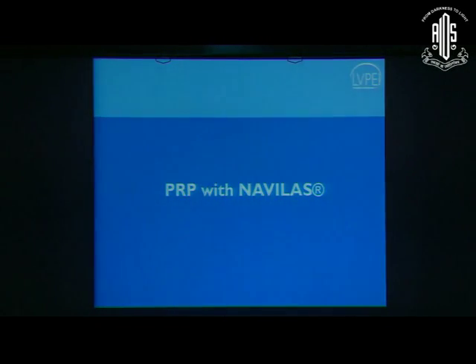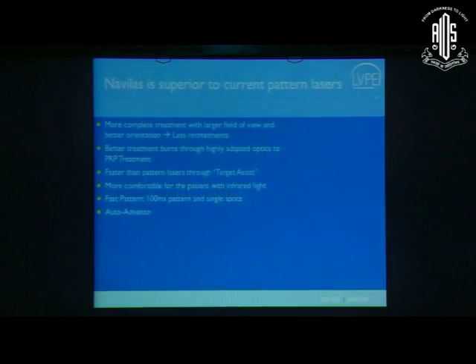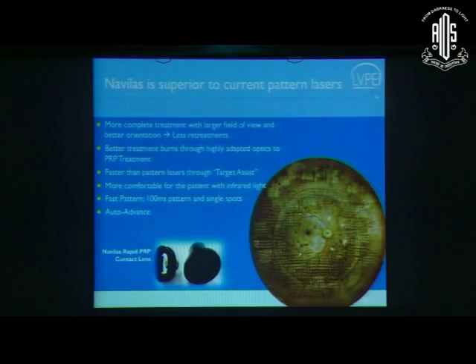Now look at the PRP with Navilas. This is something which is a pretty new thing which is coming up. If we look at the PRP, we can see that you can actually perform a more complete treatment. This is a single image. This is not a montage.